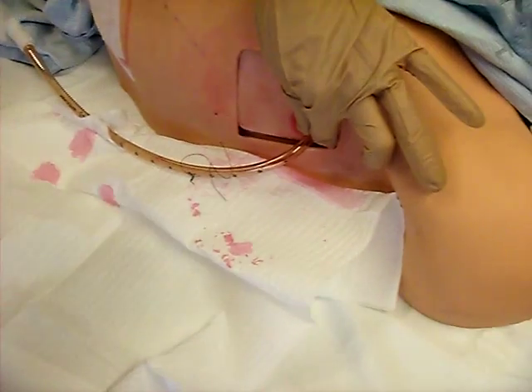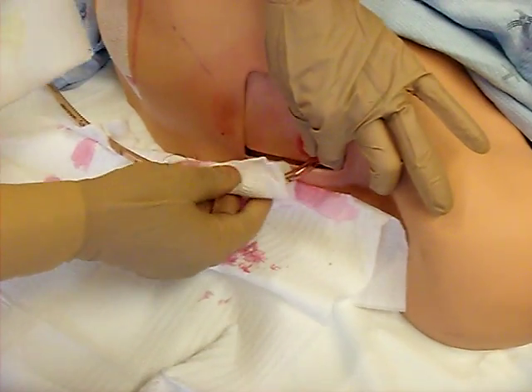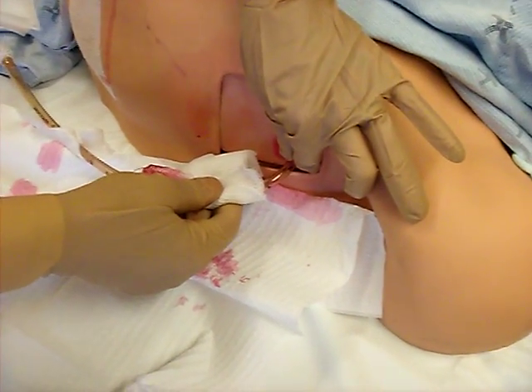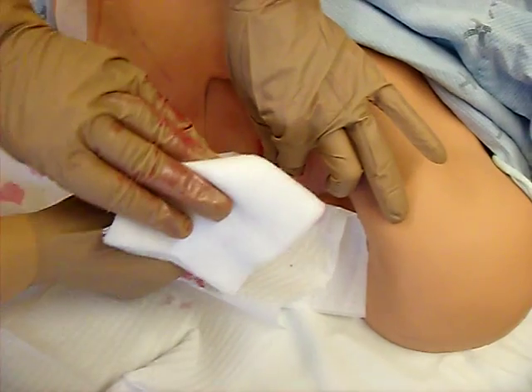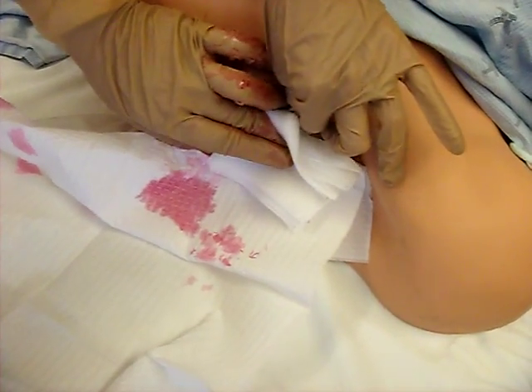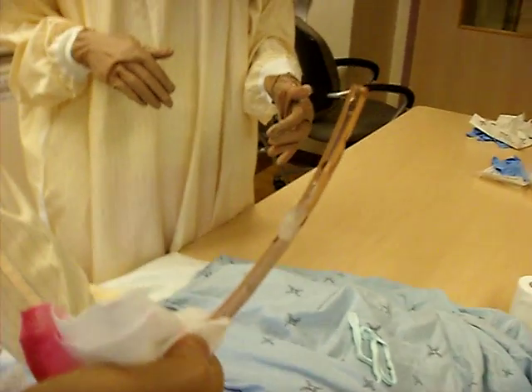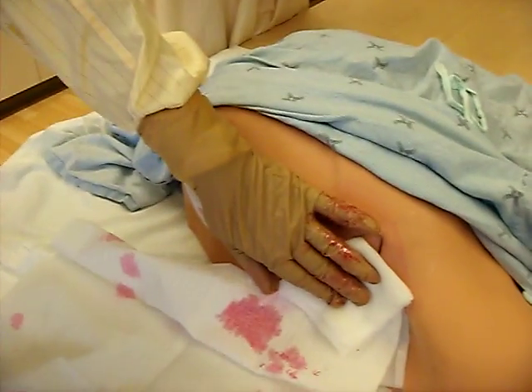All right, Mr. Smith, we talked about removing your tube, so what we're going to do now is just have you take a nice deep breath in and out. That's good. Have another breath in and out. That's wonderful. Now, the next one, I want you to hold it. Big breath in now. That's great. Hold it, and we're done. Take a deep breath. Beautiful. So if you've coordinated it right, I just want to show you, no matter how skillful you are, you're going to pick up a little bit of that Vaseline. So as I said, extra is not bad.